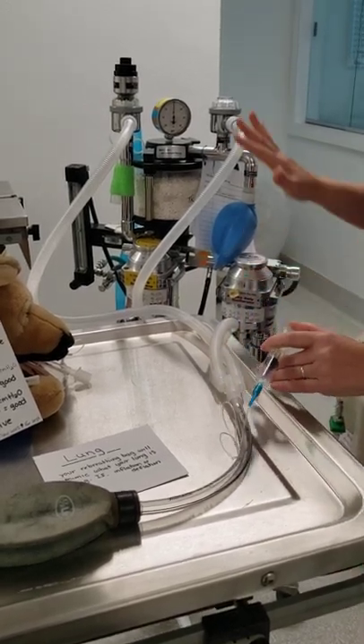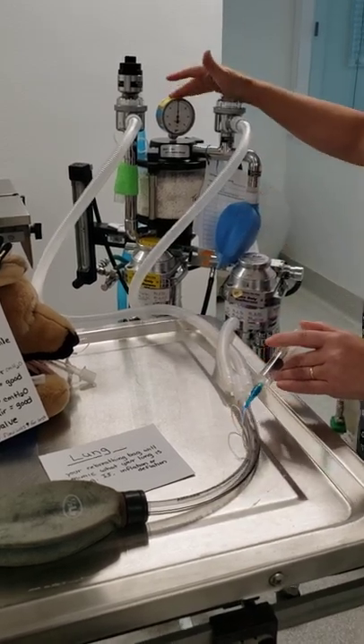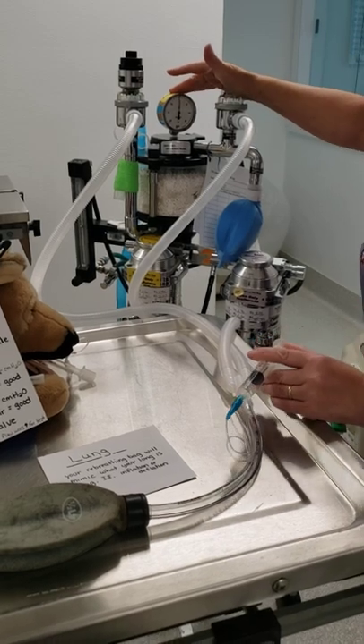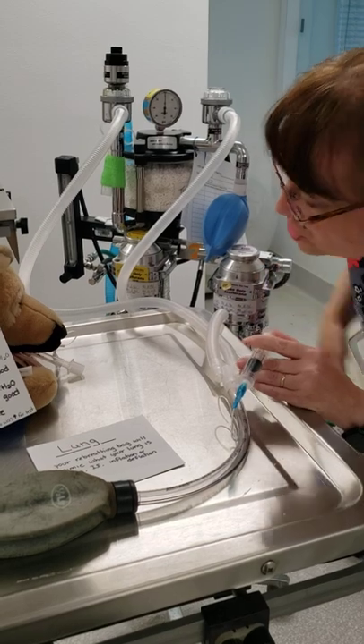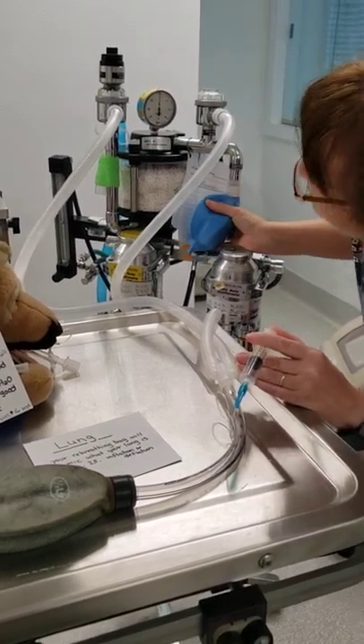As you can tell, I've halfway filled it and nothing is overflowing, and your manometer's not moving yet, so I know I've not overdone it. At this point, I'm going to put my head — which would be next to the patient's head. I'm going to watch my manometer and I'm going to be able to squeeze my bag.